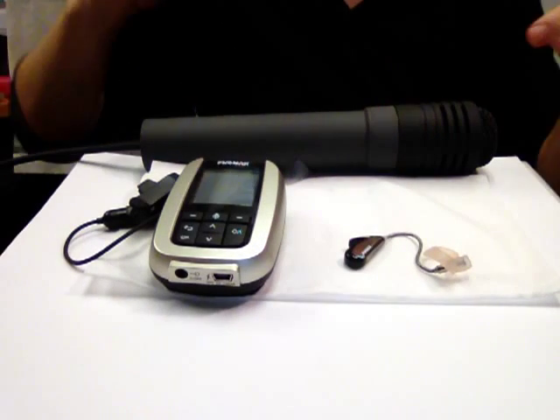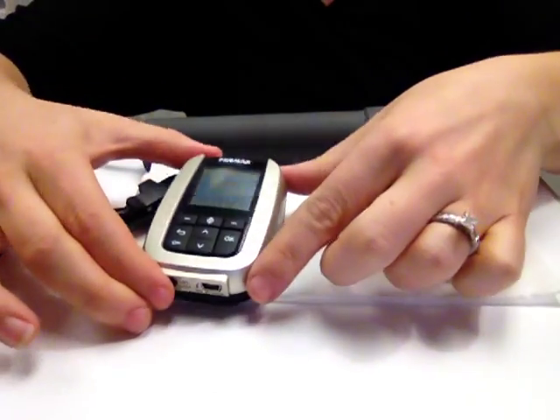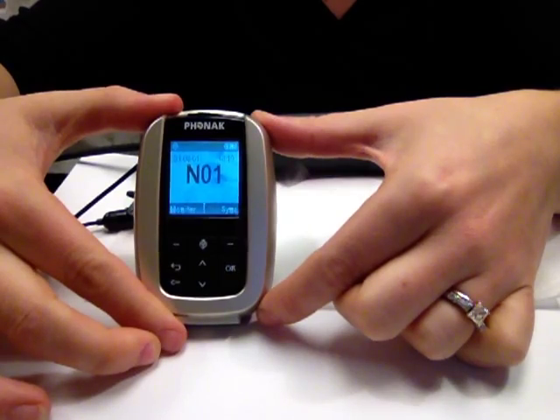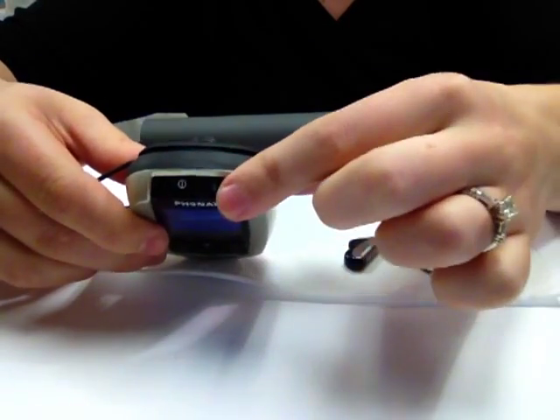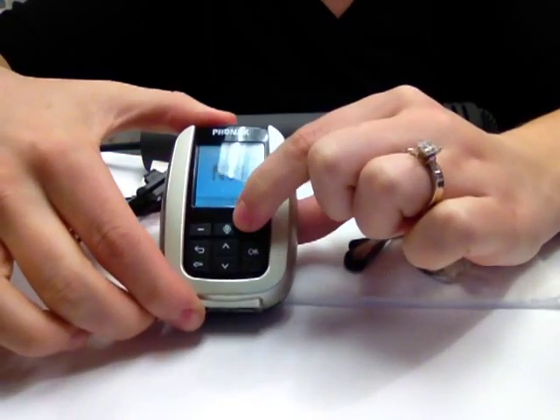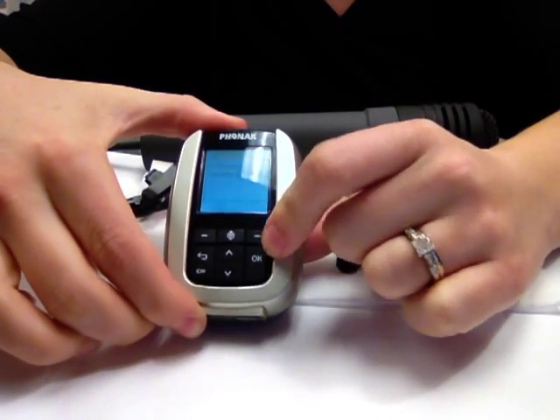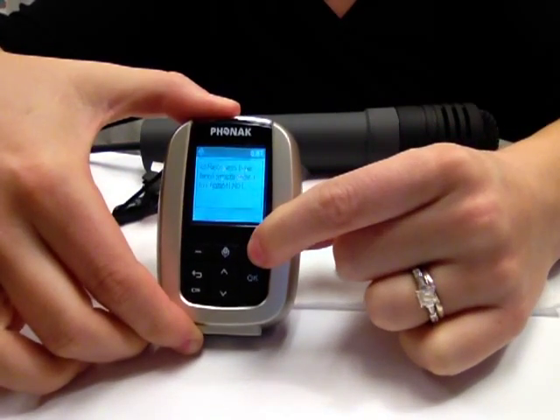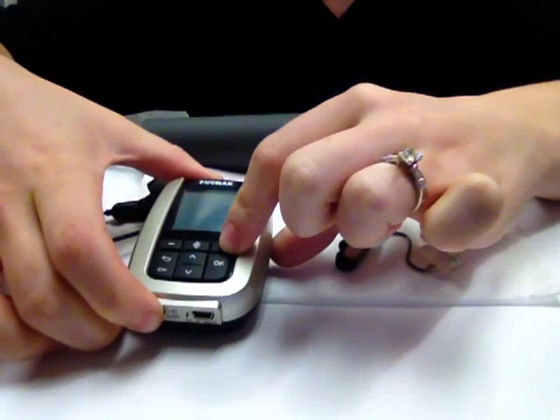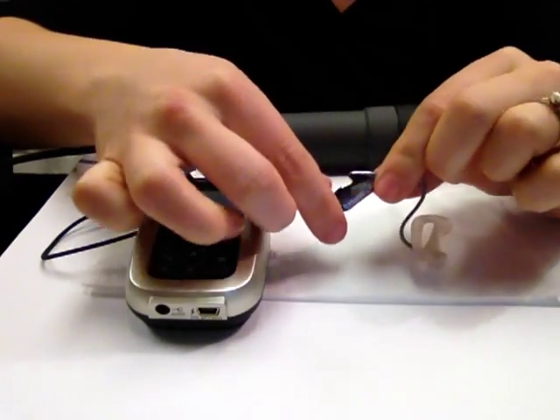If you don't hear yourself, try the following. Look at the battery counter on the face of the Inspiro transmitter to determine if it's been fully charged. The Inspiro transmitter needs to be charged in the off position each night. Check the microphone button on the Inspiro transmitter to ensure that the microphone is not muted. Push the sync button on the face of the Inspiro transmitter while holding the iSense receiver close to the transmitter and listen again. If you still don't hear your voice, check the battery again and change the battery if necessary.